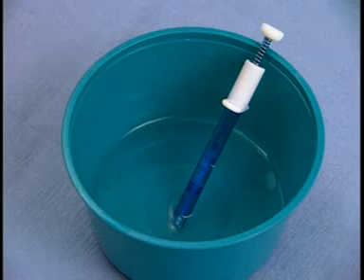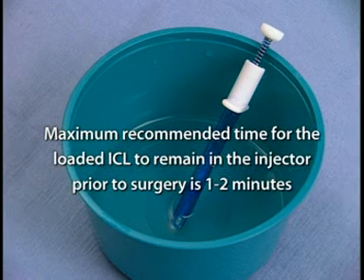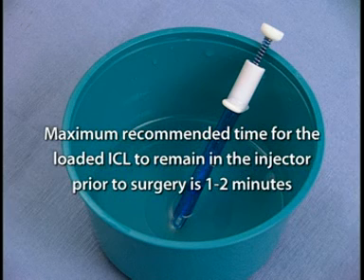Place the fully assembled injector, tip down, into a container of BSS to maintain lens hydration. The maximum recommended time for the loaded ICL to remain in the injector prior to surgery is 1 to 2 minutes. The injector is now properly prepared.